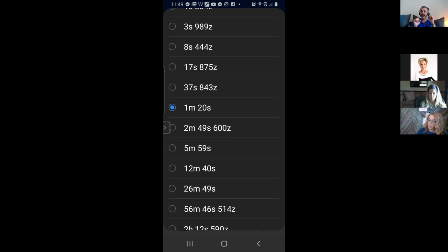Does that make sense? So you would run a shorter burst multiple times, versus a more chronic issue, where you would run a longer program, but not quite as many, okay? And I kept on trying to remind myself to grab the sheet that explains this. I believe the new manual that I uploaded to the FAQ gives the therapy recommendations for that specifically, and will say how many times to run it, and for how long, for acute versus chronic, okay?